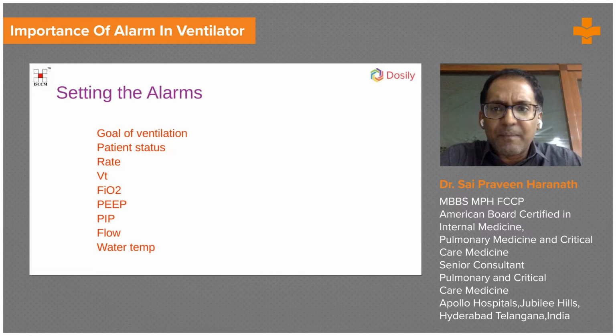If somebody has metabolic acidosis, somebody with diabetes where the insulin is not enough, sugar went up, ketones were formed, there is acid in the blood, the body is trying to blow out the acid, so you get tachypnea because of metabolic acidosis. When you have metabolic acidosis, your breathing rate is going to be high. So no point setting your alarm for a rate of 15 because the patient may be breathing at 25. So that is an alarm that you can adjust.